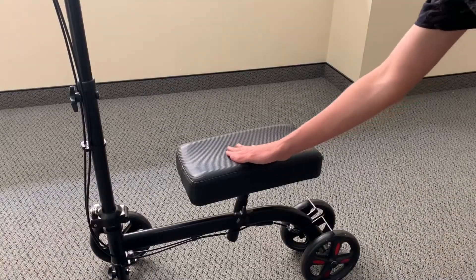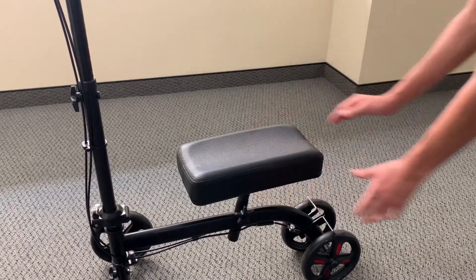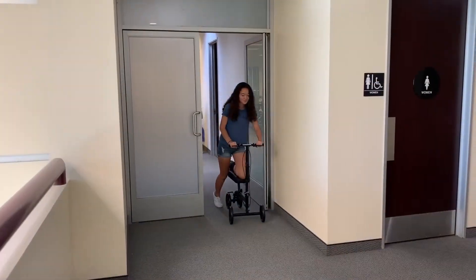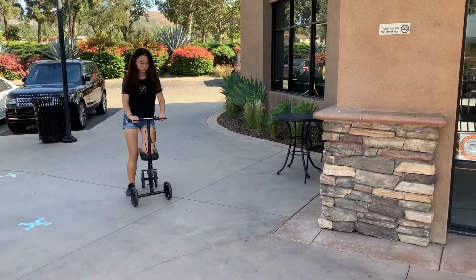The ToughCare knee walker is equipped with a padded, contoured knee platform for the user's comfort. This product is very smooth and makes sure the user has a comfortable ride. Enjoy the knee walker and have fun with it!